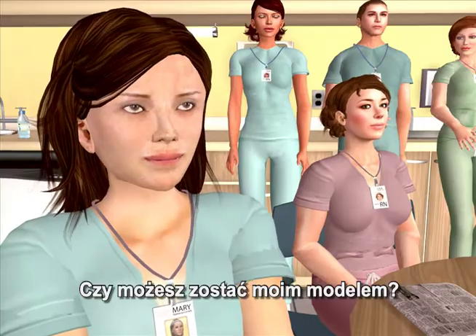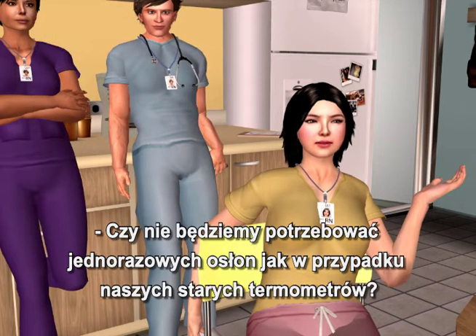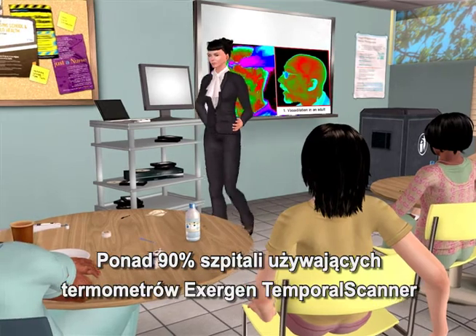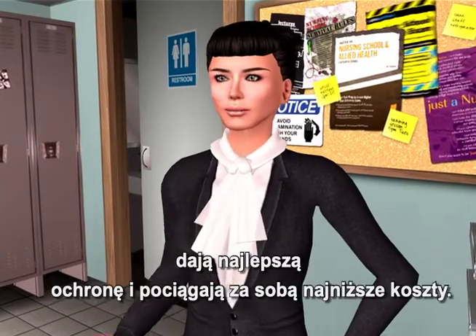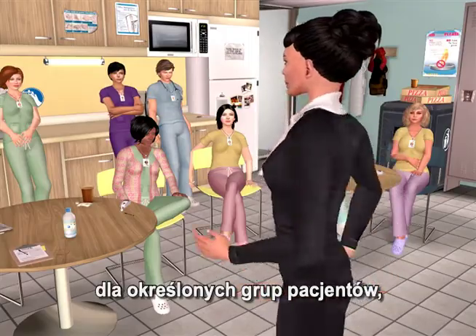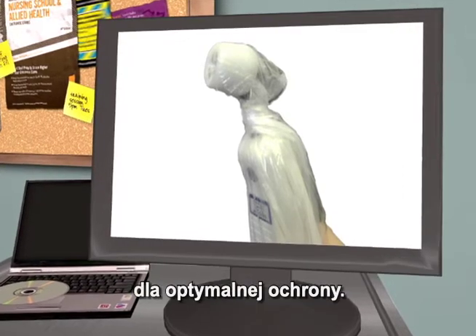Depending on the patient, you would first wipe the probe head with an alcohol prep pad, as you would with your stethoscope. With the temporal scanner, you are not contacting any mucous membranes, so in most cases, covers are not required. More than 90 percent of hospitals using Exergen temporal scanner thermometers have approved wiping with an alcohol prep pad. Should the hospital prefer additional protection for certain patient populations, we offer disposable caps, which can be reused on the same patient, and for isolation patients, a long tubular sheath that encloses the entire thermometer for optimum protection.